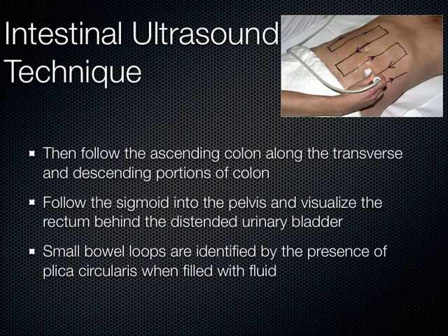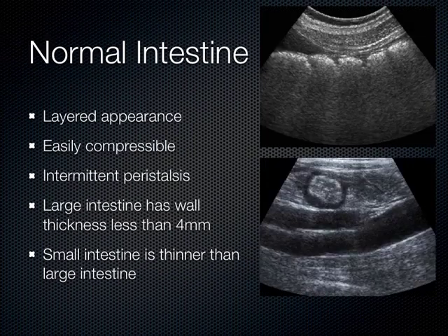And then, again, to try to differentiate small bowel from large bowel is difficult to do with air-filled loops of bowel in normal individuals, but when patients have disease states, then you can really make out the plicae circularis. I'll show you some examples of that.